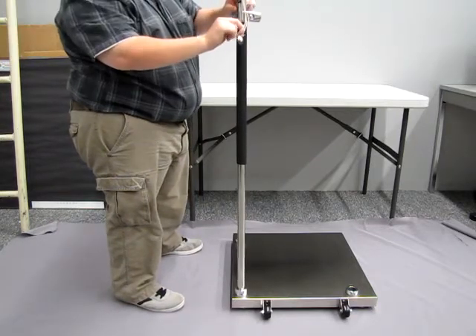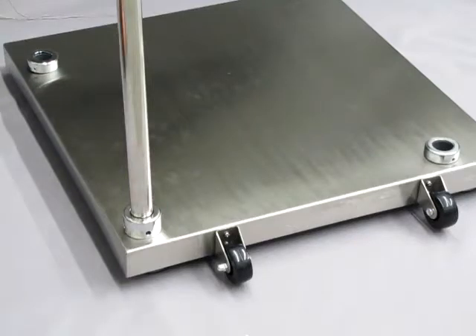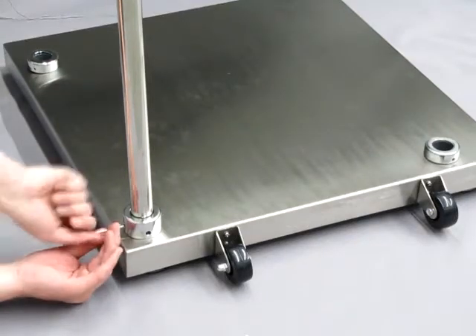Next, insert the column into its proper socket on the platform and fix it to the platform using the screws inside of the socket.